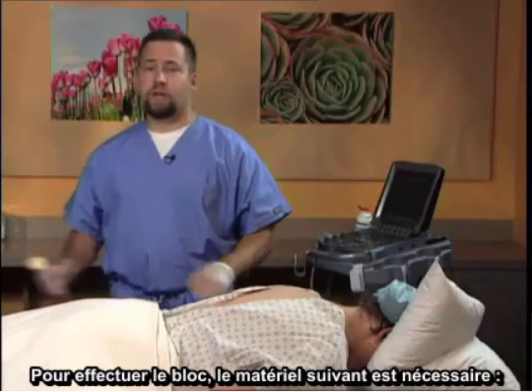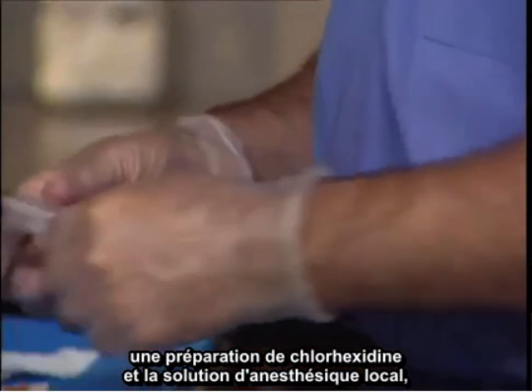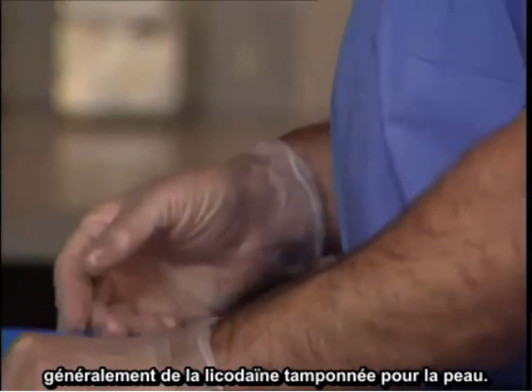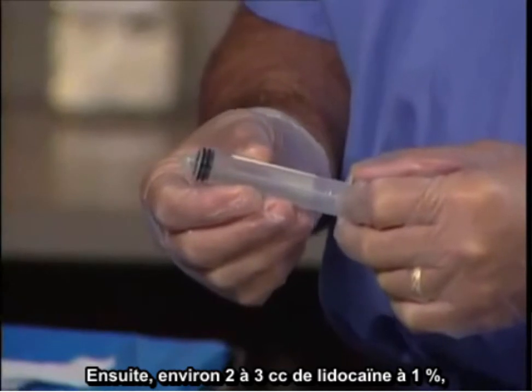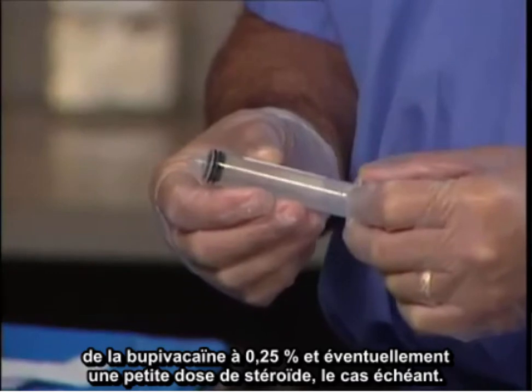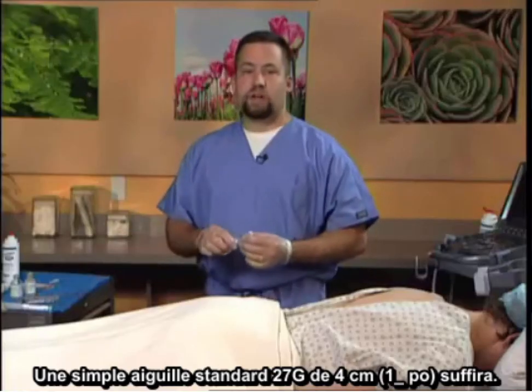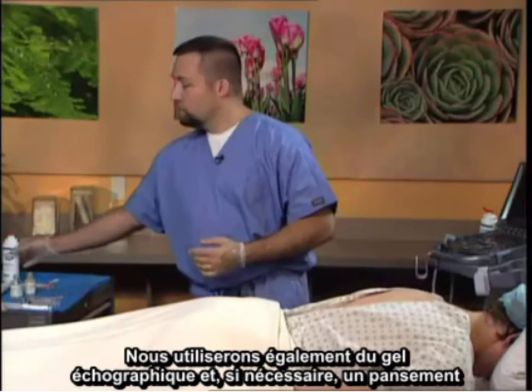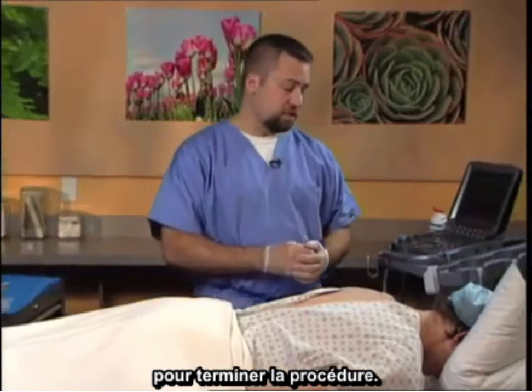To perform the block, the following items are used: chlorhexidine prep and the local anesthetic solution, typically a buffered lidocaine for the skin. Below this, approximately two to three cc's of one percent lidocaine and quarter percent bupivacaine and potentially a small amount of steroid if desired. The needle size is simply a one and a half inch standard needle, 27 gauge will suffice. We will also use ultrasound gel as well as a band-aid if necessary for the conclusion of the procedure.